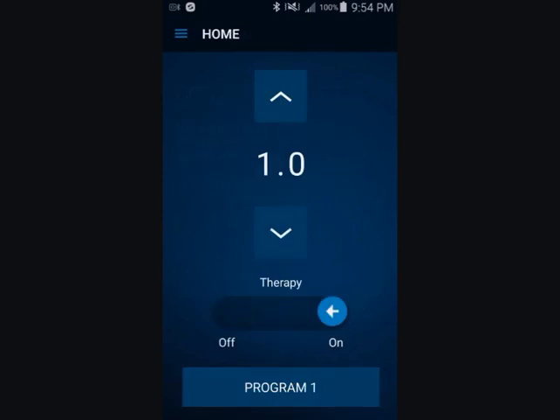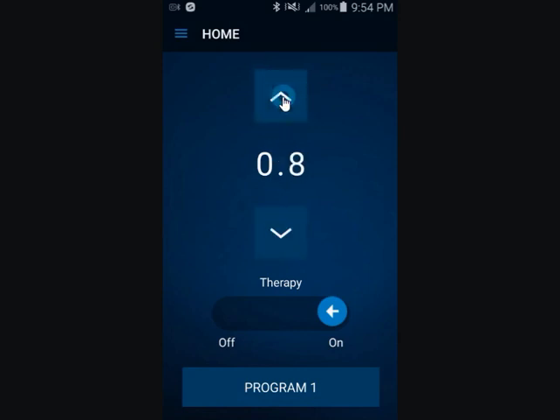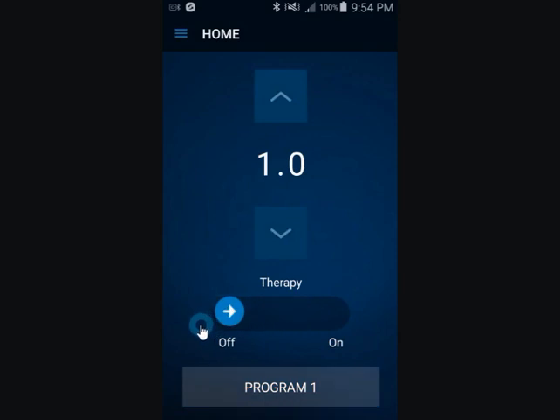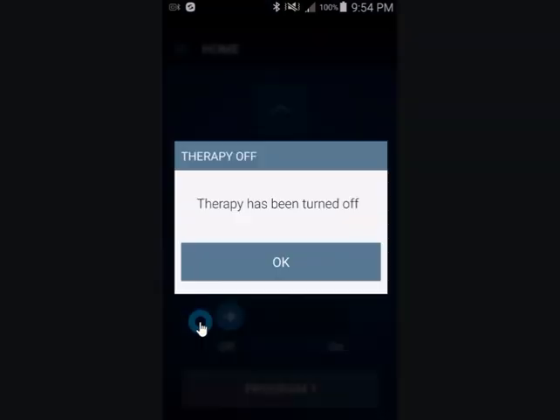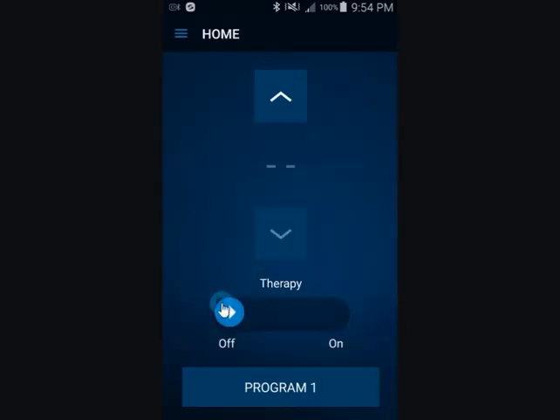Notice that the therapy screen appears. From here you can use the up and down arrows to change the stimulation level. Slide the arrow to turn stimulation off. If therapy is turned off, a Therapy Off notification appears. Tap OK. Slide the arrow to turn stimulation back on.